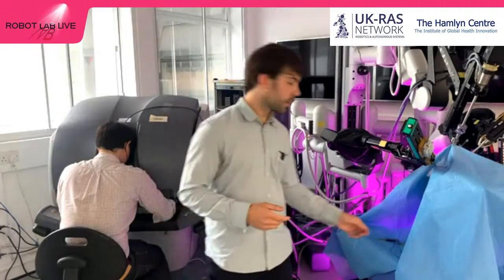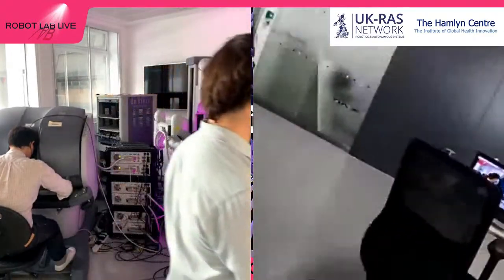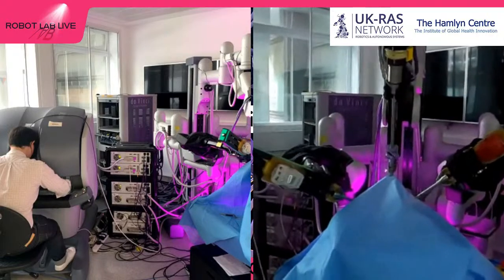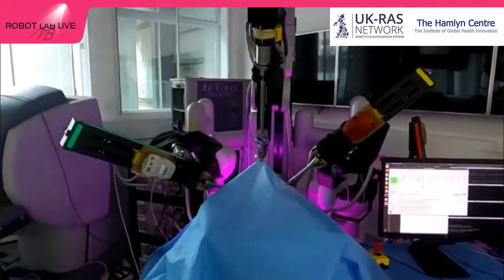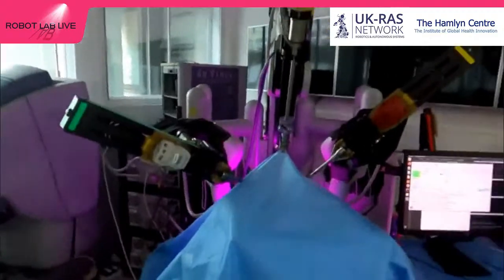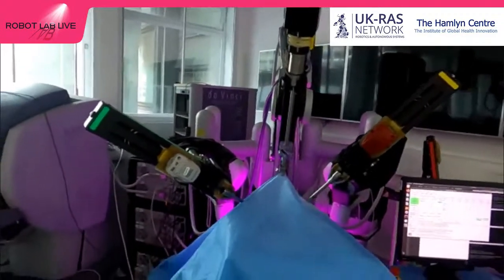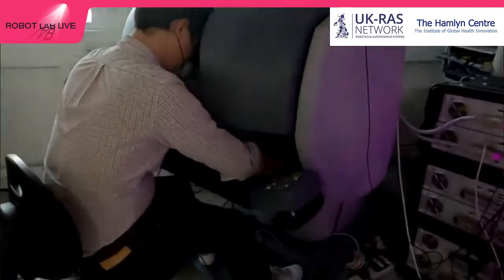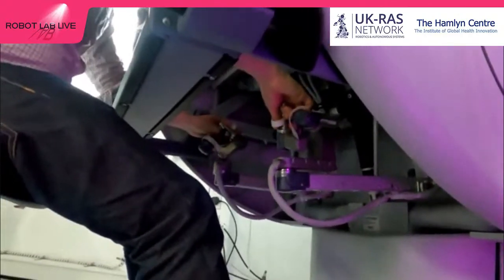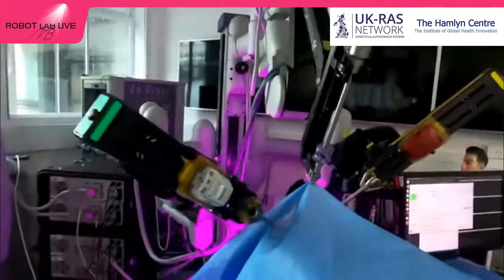That is called the da Vinci, and this robot is the one that I have behind me. As you can see, it has two arms that are moving at the moment: the red arm on the right, and the green arm on the left. These two arms are as if the surgeon had his hands inside the patient. And to move them, our surgeon for a day, Sen, has a console with a bunch of handles, to be precise, that he moves to control these two arms.